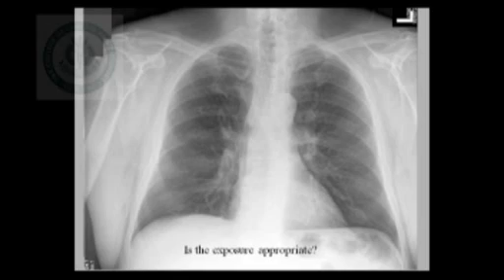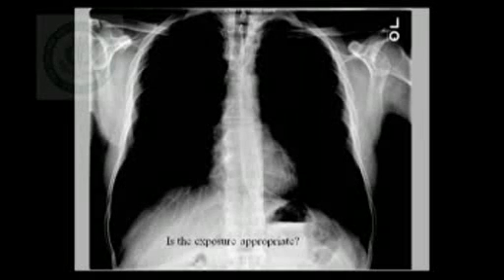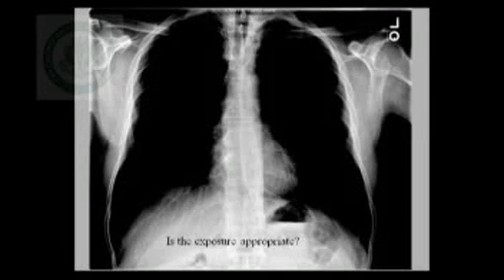Now this particular thing is talking about the exposure of the patient. Normally the adequate penetration is important. Adequacy of exposure is one important factor which is very important to determine whether there are subtle lesions in the lung field. If it is an overexposed film like this, you may not be able to pick up subtle abnormalities.